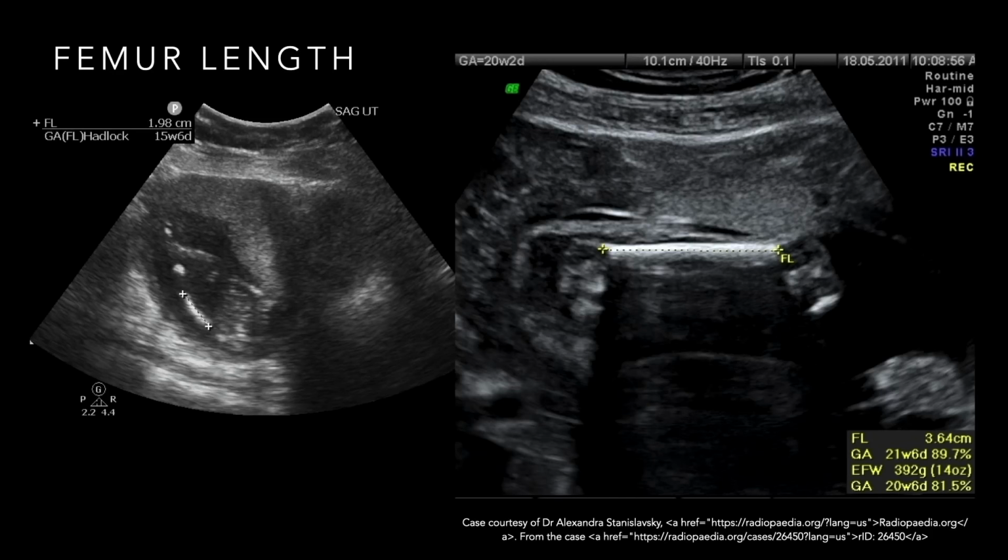And that leads us to our third and final method of assessing second and third trimester gestational age, and that's the femur length. And this one, it kind of goes without saying, just because it is self-evident that you measure the length of the femur. Although I've certainly seen this messed up in a number of different ways over the years. And so the idea is you just find the femur, right? Find the full length of that femur and measure it from essentially the femoral head down to the femoral condyle on the other end.